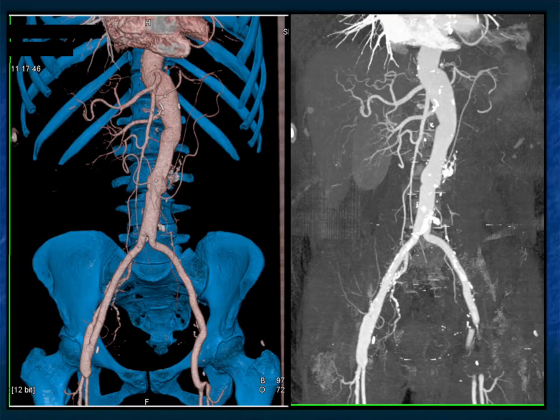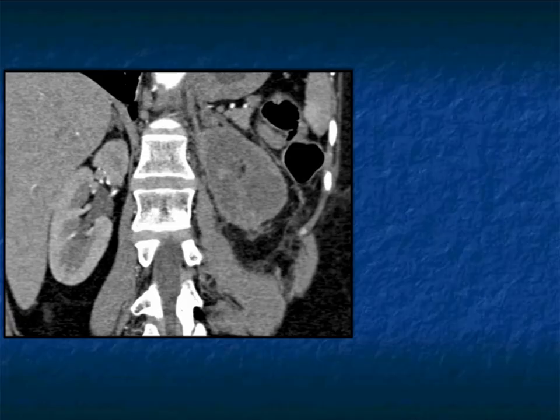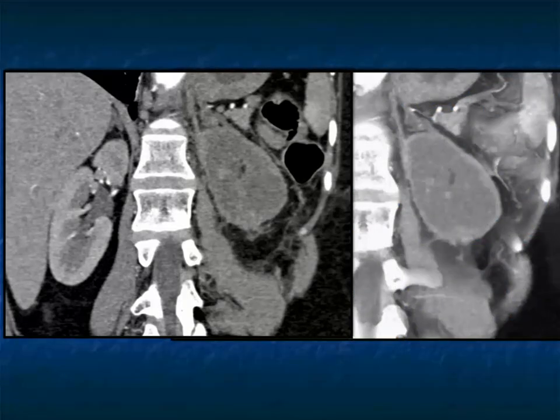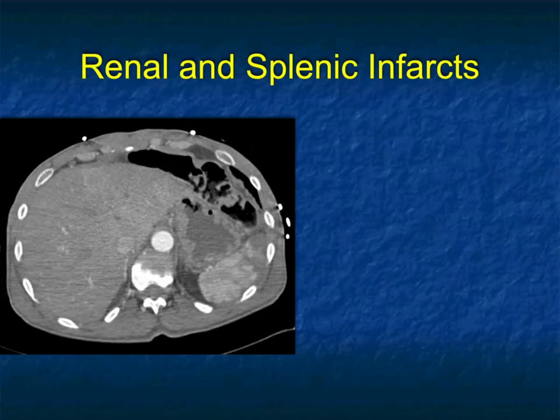We can see all sorts of reasons for arterial injury — trauma, but trauma could be iatrogenic. This patient had an aortic aneurysm repair. You see the right kidney and right renal artery very nicely, but you do not see the left kidney or the left renal artery. This patient had an infarct of the kidney as a complication of the aortic aneurysm repair.